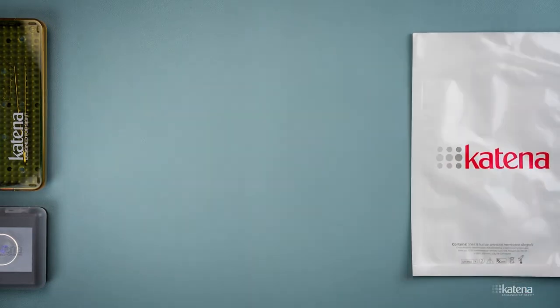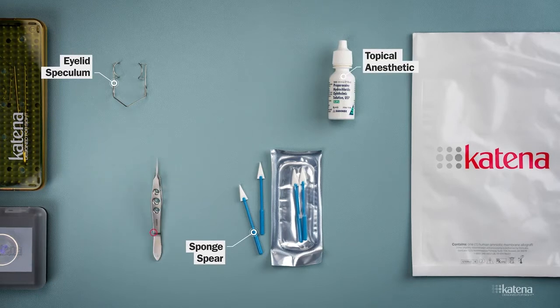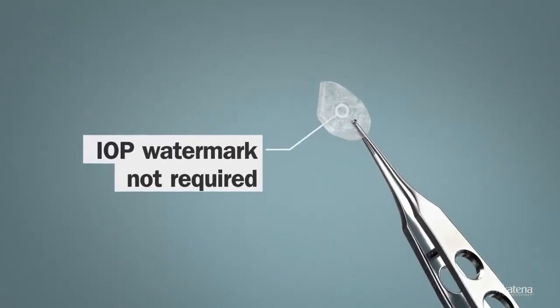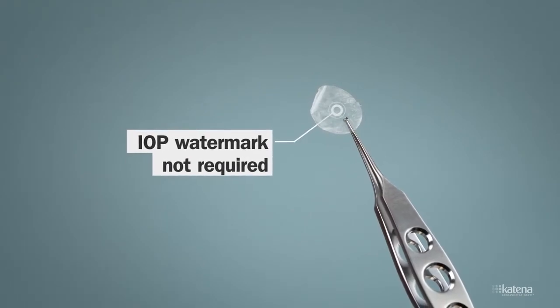To place the AmbioDisk, you will need the following items: an eyelid speculum, a sponge spear, a drop of topical anesthetic, a toothless forceps, and a bandage contact lens. With the new AmbioDisk, the IOP watermark is no longer needed. The tissue is packaged with the basement membrane facing upright.